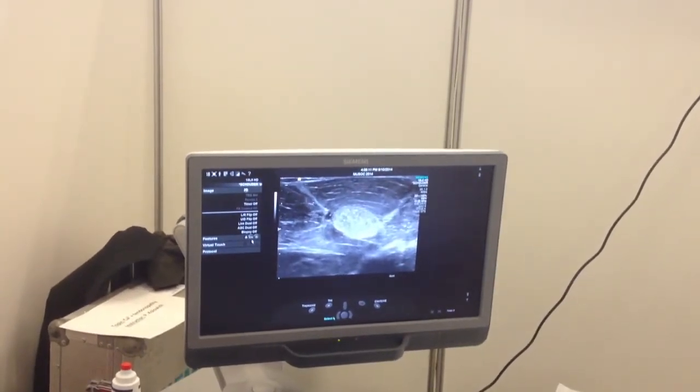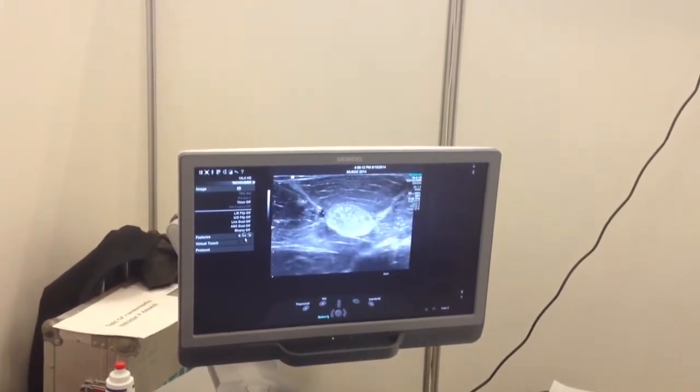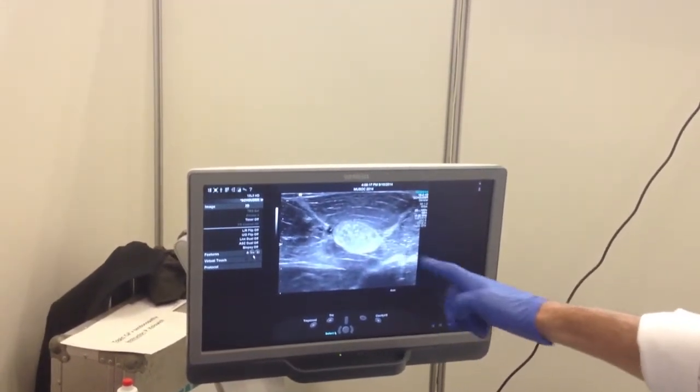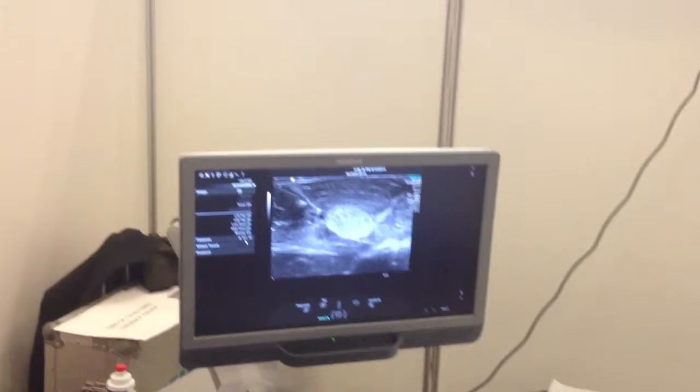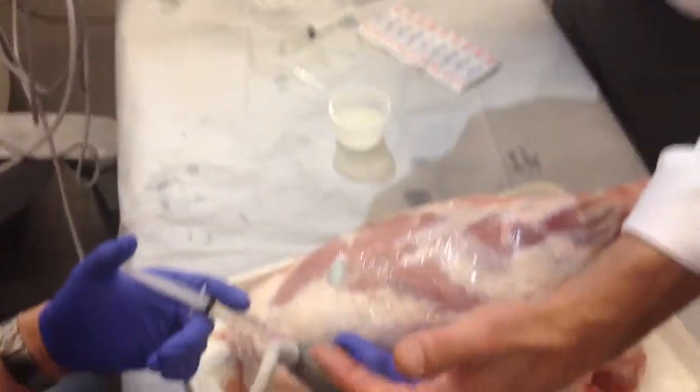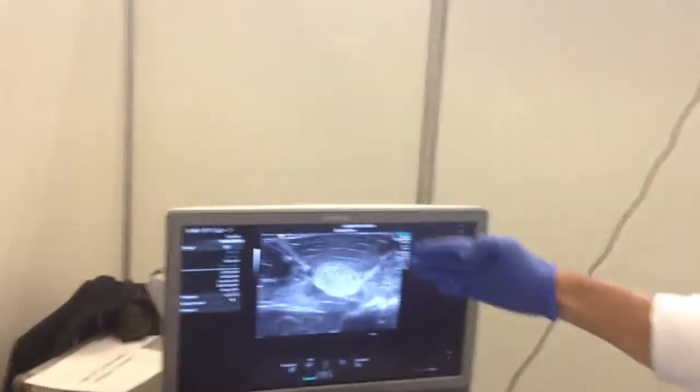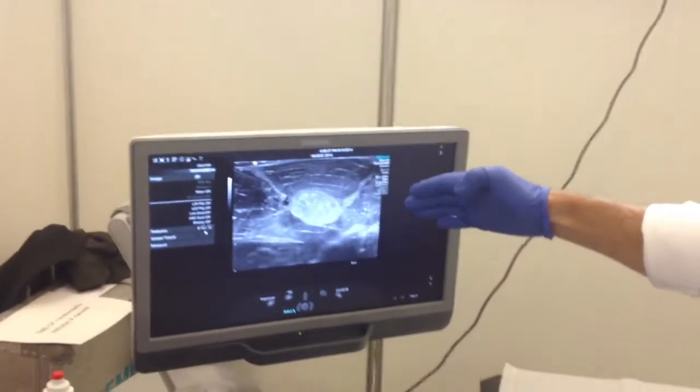So look here. Maybe the plane would be like that. Make sure you're in the same plane, because this is the plane you want, so you have to adjust a new plane for it. Now get closer. Go at the surface of the calcification.